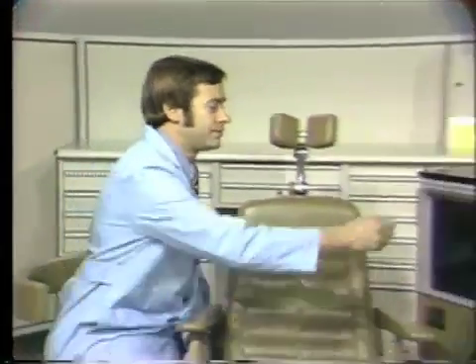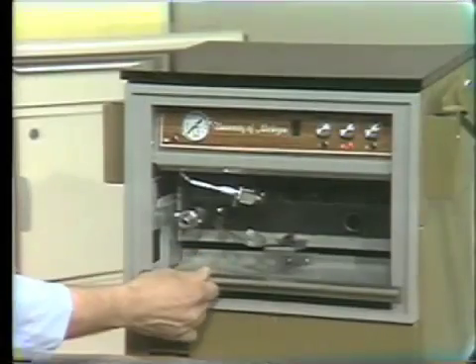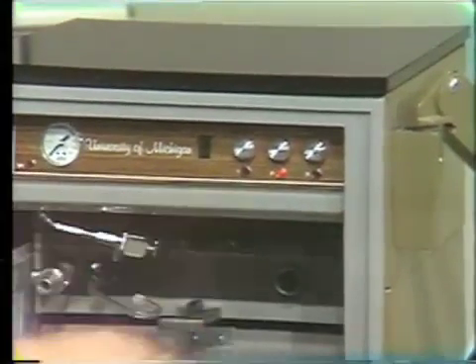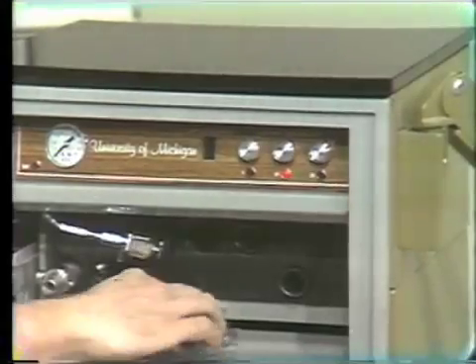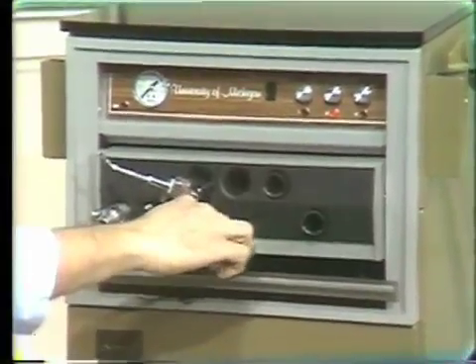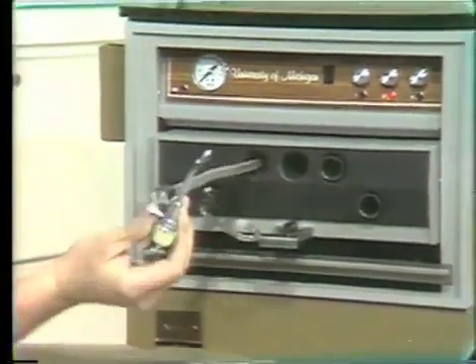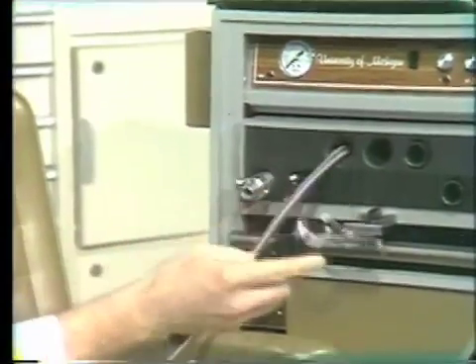The unit is turned on by sliding this door down. Be sure that the door is all the way down and that these red lights here are on prior to use of the unit, because if the door is not all the way down, the unit will not be completely on. The next thing to do is to grab hold here and pull this out. The only things we'll be using today will be the combination air-water syringe, and it is a two-way syringe.